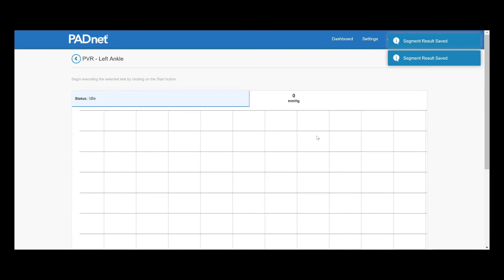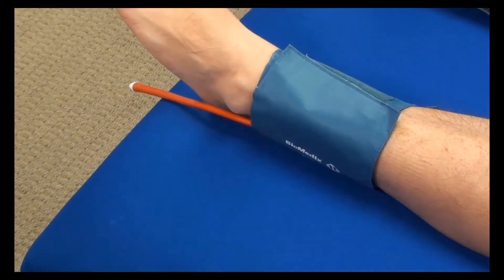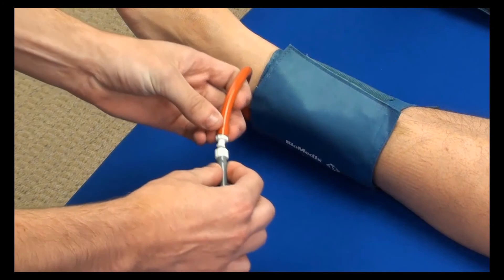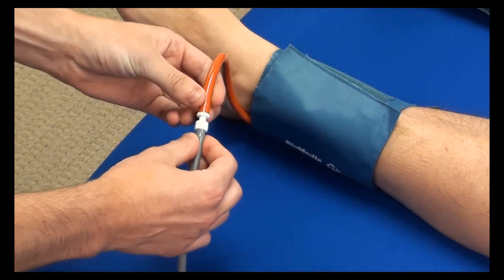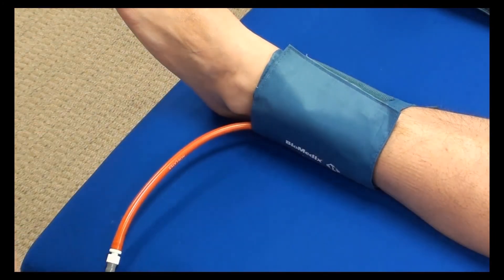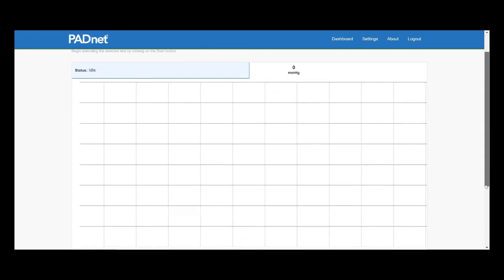Now that we're on the left ankle, we'll move our gray extension hose from the right cuff to the left ankle cuff. From here, we'll conduct our second PVR study on the left ankle in the exact same manner as we did before.